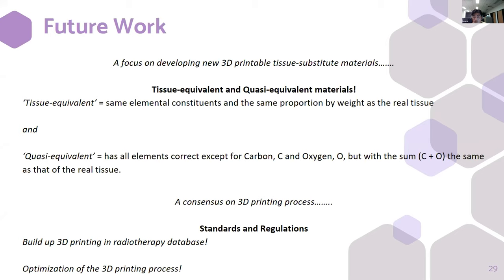By then, we can start working towards analyzing key 3D printing parameters, machines, and materials that are essential for specific radiotherapy applications, and will hopefully guide us towards the proper development of standards and regulations.